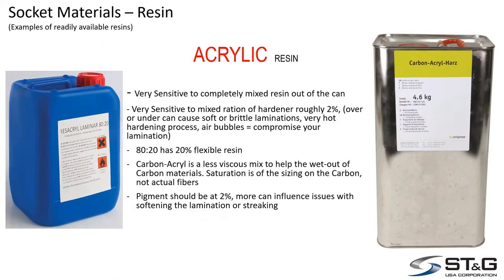Now, acrylic in the can, if you let it sit for a very long time, it will start to separate. So it is very sensitive to this ratio within the can. So before you open it, it's a good idea to go ahead and vigorously shake it to remix those parts. If you get an 80-20 resin, which is very common, you're going to have 20% flexible resin in there. Where it separates to the top or the bottom, I am not sure, but if you let it sit, you're going to get more of one resin than the other. And as you get towards the bottom of the can, if it's that 20% flexible that's sitting on the bottom and you haven't shaken the can, you're going to get more flexible resin out of it as you get to the bottom. So that's one of the things to think about.